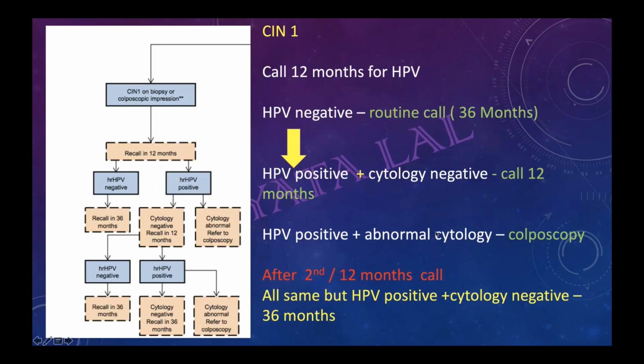Okay, so this is the explanation. This is the first part of the table. As I am in the colposcopy clinic and I found that, yeah, this is not normal. There is some abnormality. I find some mild changes there, or if there had been any previous biopsy, on that previous biopsy, CIN1 was there.